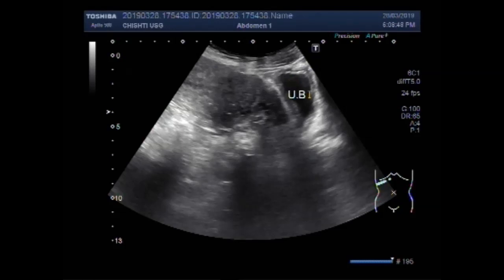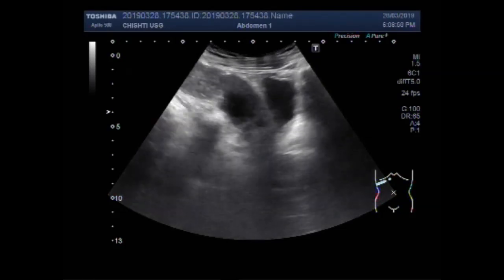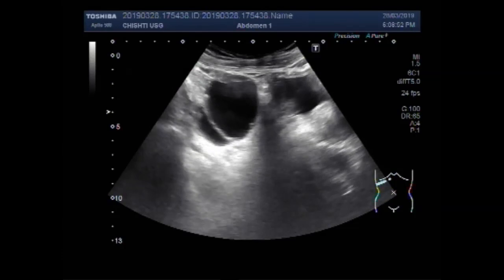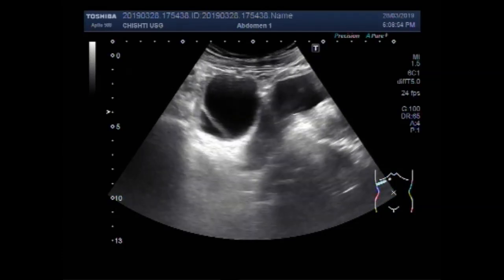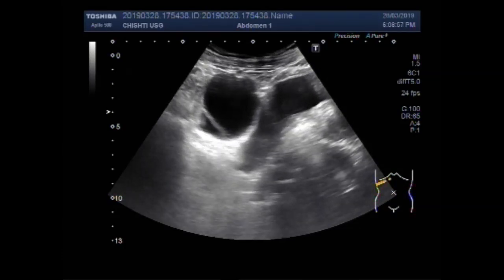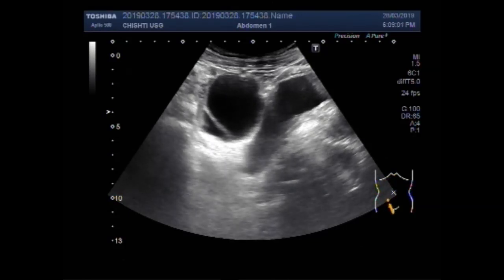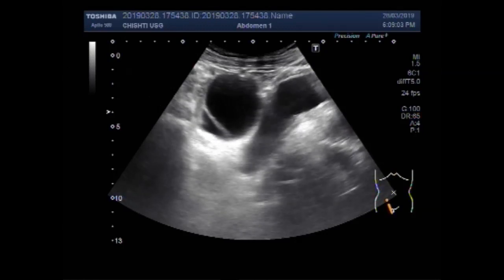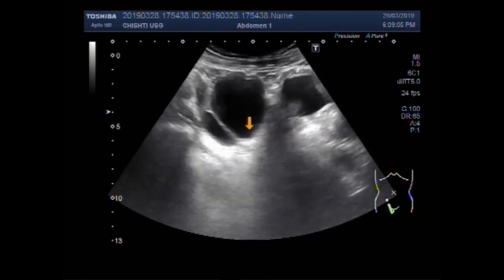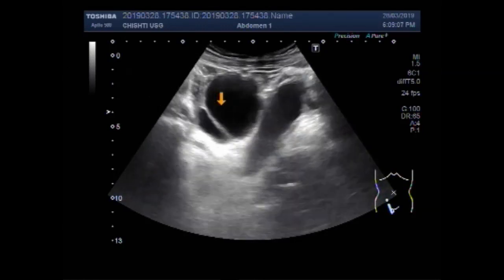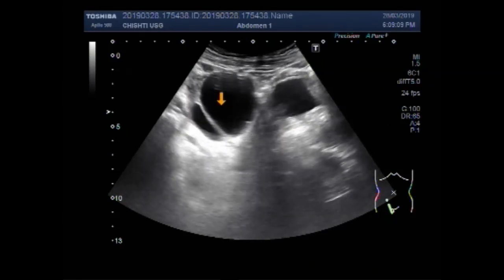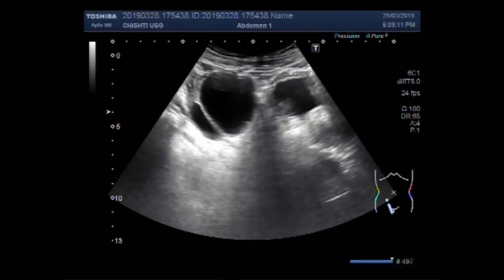This is the urinary bladder. You can see the urinary bladder as well as the right ovarian cyst. It is a bit tricky sometimes to differentiate between the ovarian cyst and the urinary bladder. Now this one is the right ovarian cyst and this is the urinary bladder.